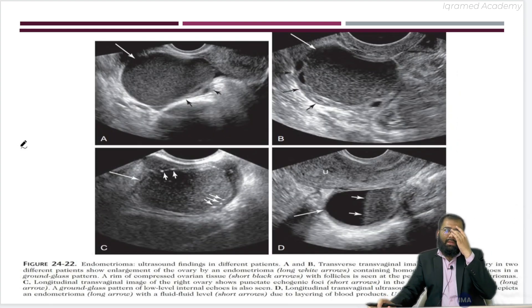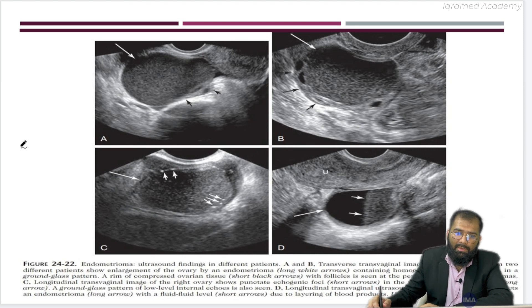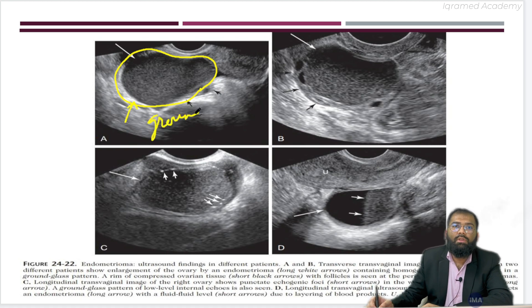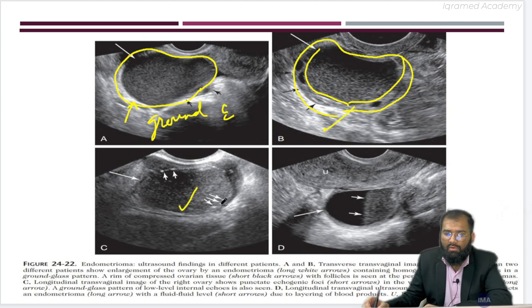We have seen various signs: one is ground glass opacification, one is kissing ovary sign, and they can be multiple — we have shown you multiplicity. Now in this image, you see this is the ovarian cyst, and within this cyst there is a classic ground glass appearance — again a case of endometrioma. Here, this is the ovary, and within the ovary again there is a ground glass cyst with fine moving echoes — endometrioma. This is again a similar case of endometrioma.